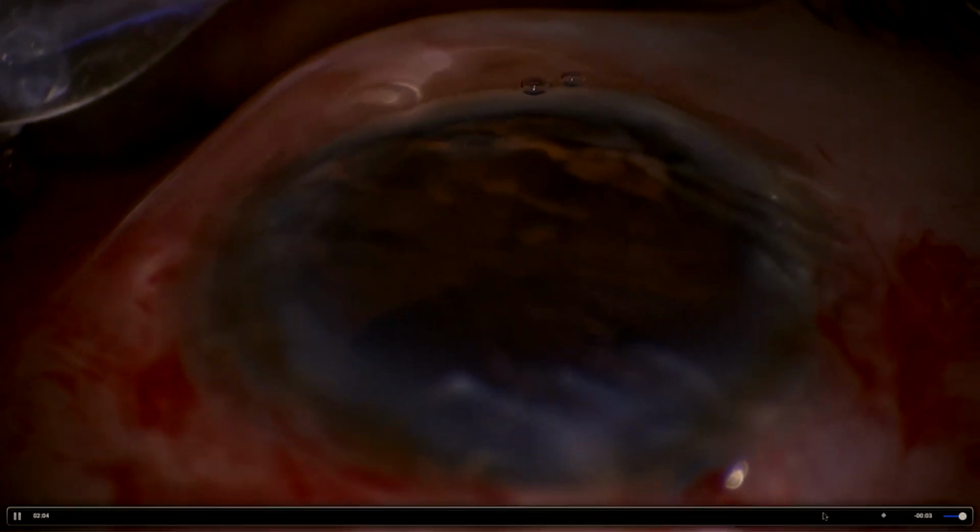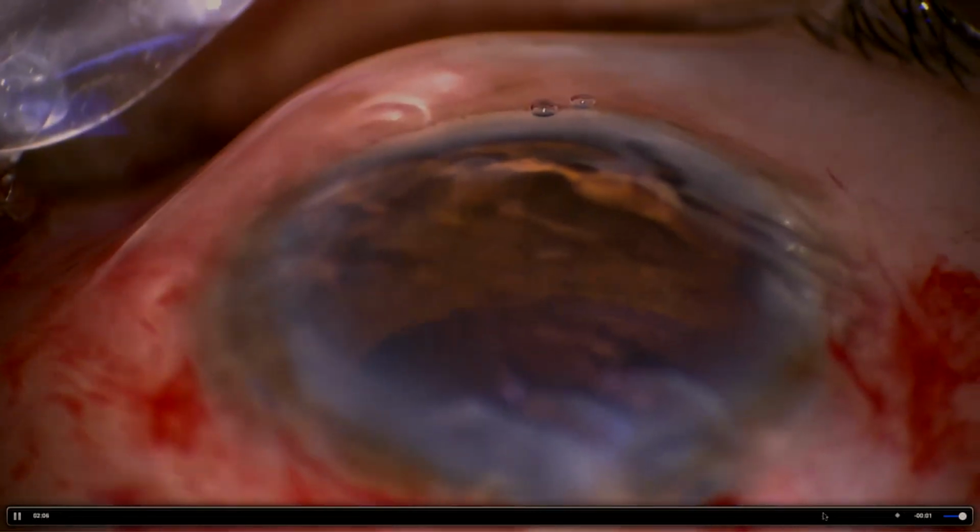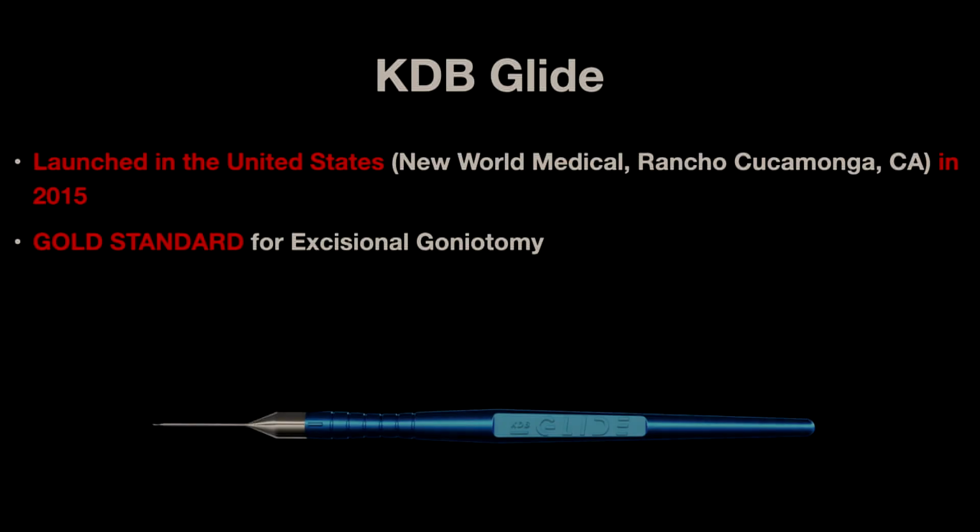When you put some saline, the field is again cleared and your video recording quality improves. So this is just an unedited 2-minute video that I wanted to show, to demonstrate how, once you master the procedure, you can really take things forward.